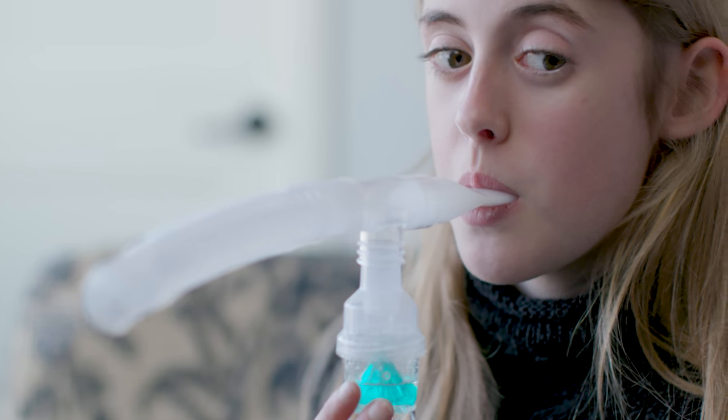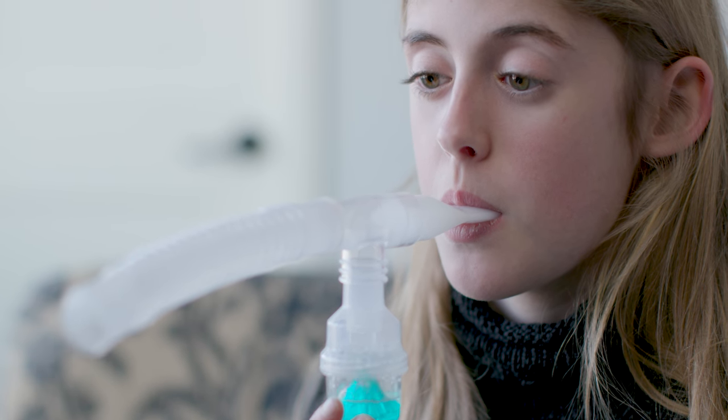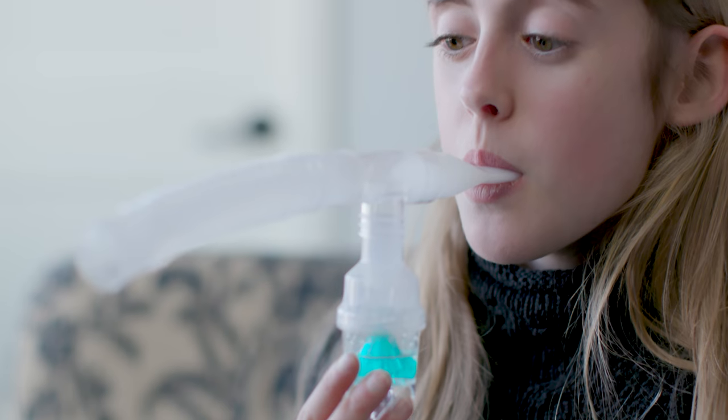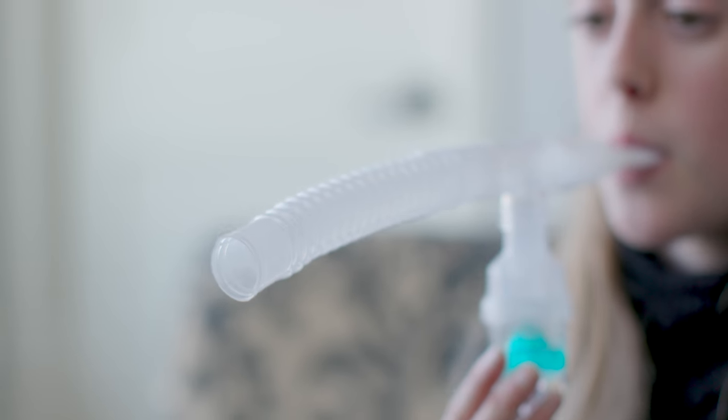If possible, the patient should sit upright and breathe normally during the treatment. While it's not required, taking a big breath and holding it for a few seconds can improve delivery of the medicine into the lungs.